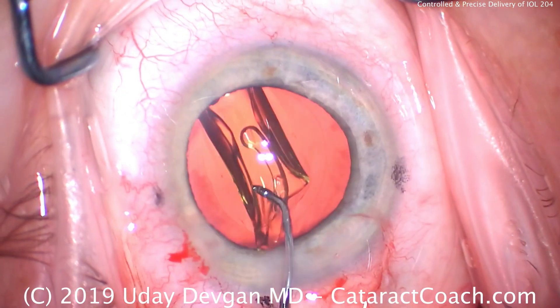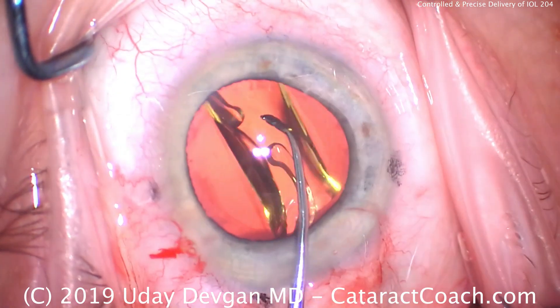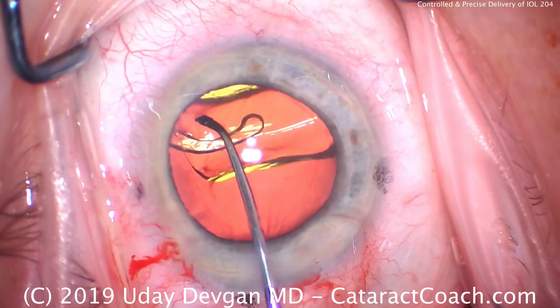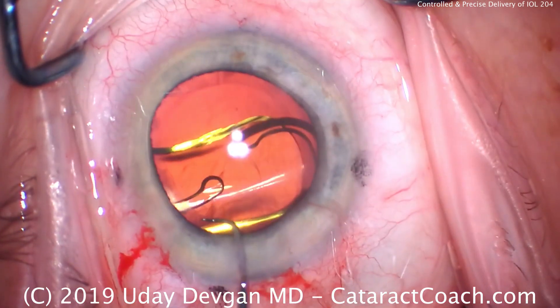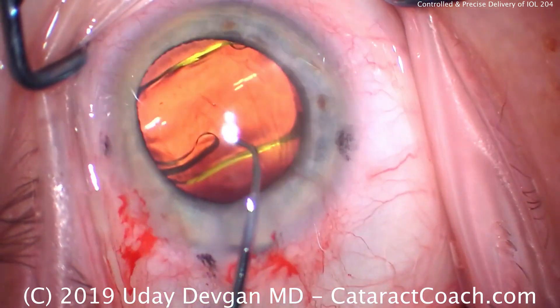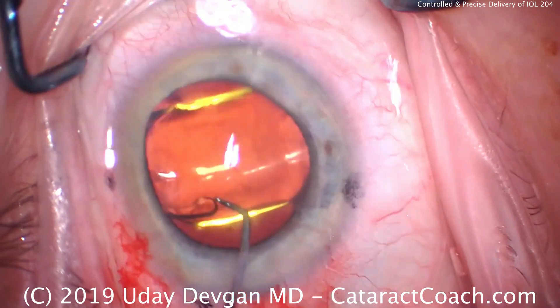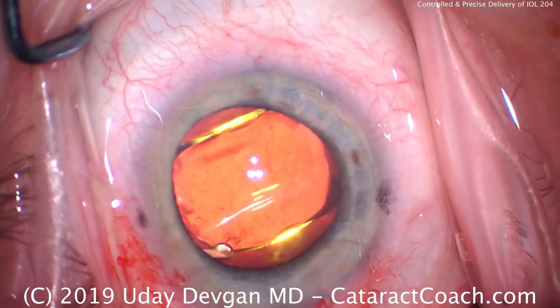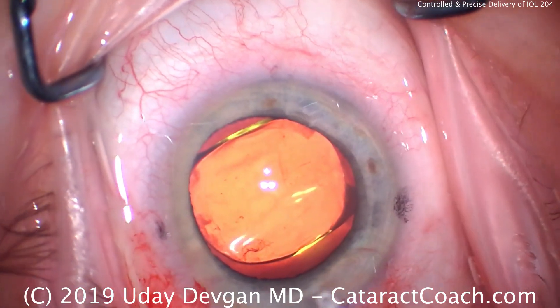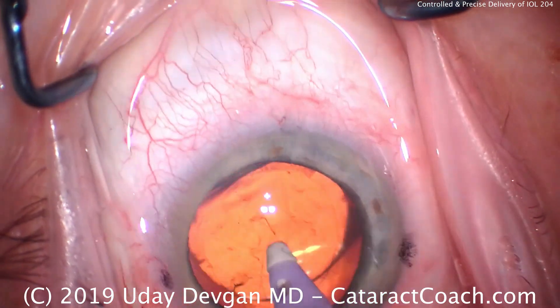Using the chopper to make sure the entire lens goes into the capsular bag, and prior to the haptics opening, let's rotate the lens into a preferred position — that looks great. Then assist that second haptic to open, and you can see it looks fantastic. There's a good overlap of the optic by the capsulorrhexis. Remove our viscoelastic and finish the case.